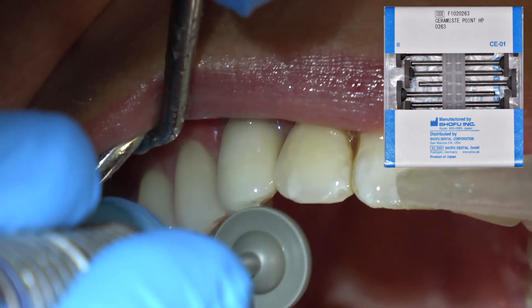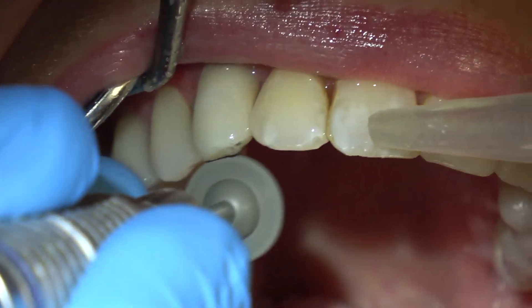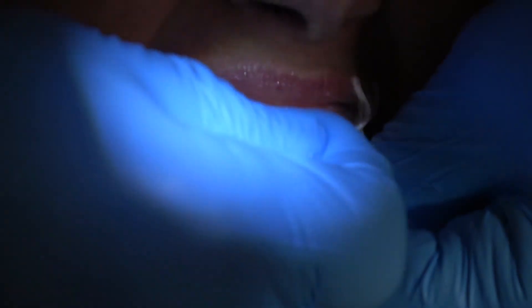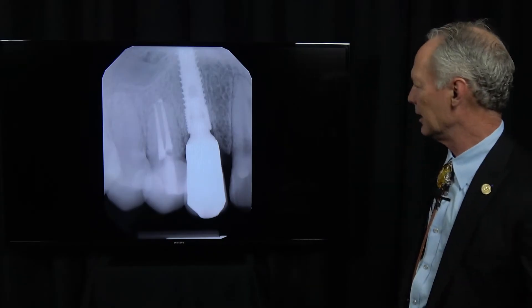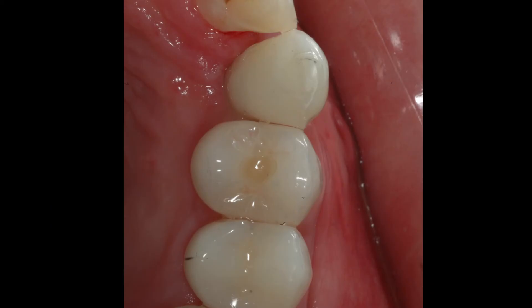We're just polishing — this is a Shofu rubber wheel, making sure everything is nice and smooth. Check contacts — nice tight contacts. Final radiographs show everything is perfectly seated into the implant. After photo, right after we've seated it, the contacts are ideal.